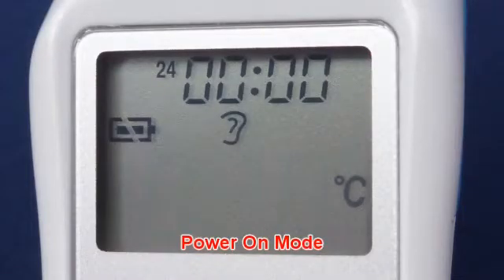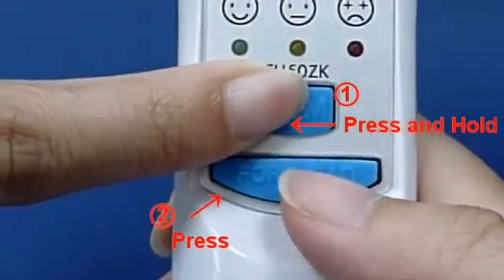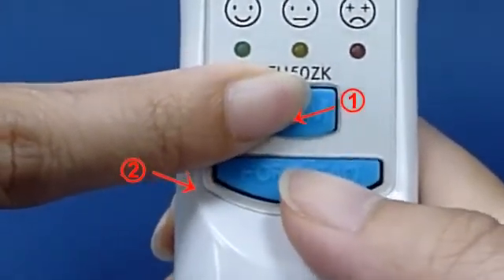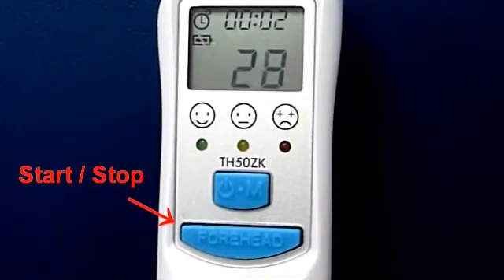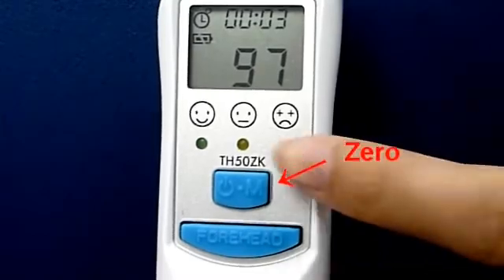In Power On Mode: press and hold the On Memory Button, then press the Forehead Button and repeat the process. Press the Forehead Button to start the stopwatch, and press the On Memory Button to zero it.